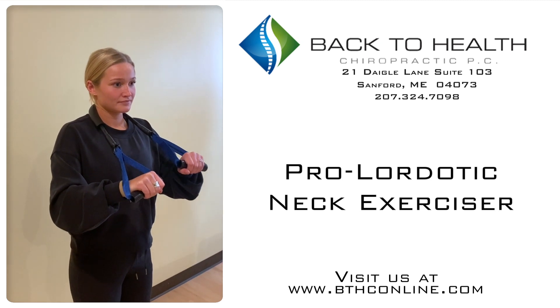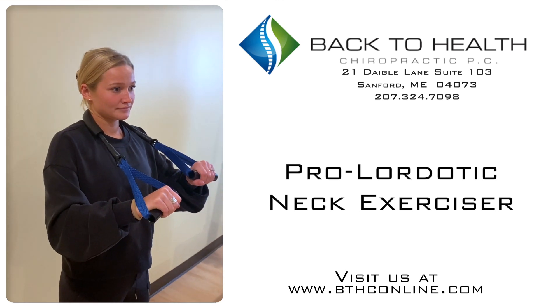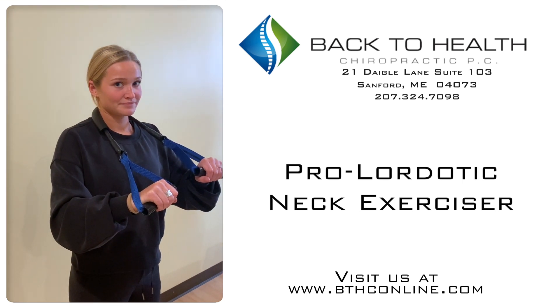We're here with CA Josie. We're going to be demonstrating the Pro-Lordotic Neck Exerciser. This is a great tool for general mobility in the neck and also used as a warm-up prior to cervical spine deni-roll use.